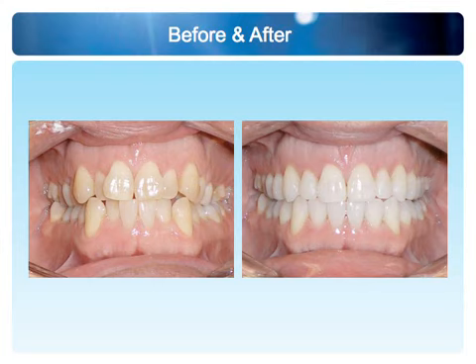When you look into the posterior segment, you can see the buccolingual inclination. You can see what I mean now. They are upright. And when they're upright, we don't have the interferences that we have over here. Because all of the inclines on these posterior teeth hit, and that produces interferences, lateral or horizontal forces, and really an occlusal design that is going to destroy those teeth and those fillings and that gum and bone eventually. Whereas this is much healthier and a proper occlusion, even by the best of orthodontic standards.